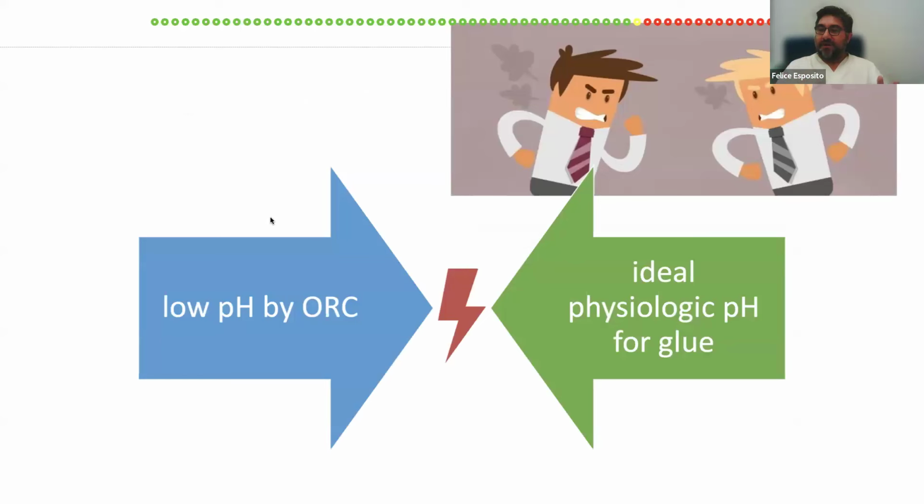Every one of us uses this, but the two things together should not be used because the Surgicel and the Tabotamp and things like this have a low pH, and that may cause some problem in the effectiveness of the surgical glues, like fibrin glue.